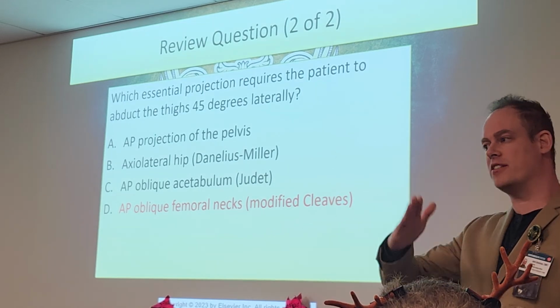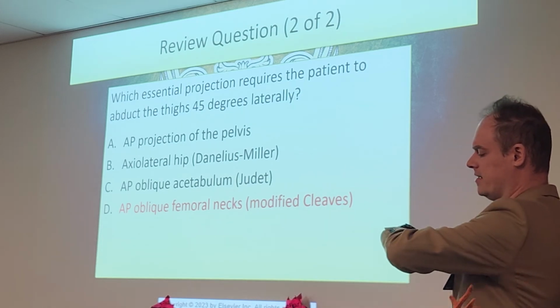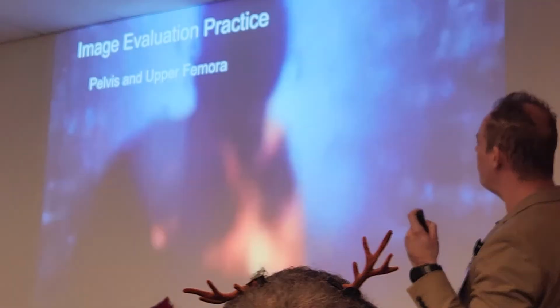We let it go to the side. We abduct it to the side at least 45 degrees.